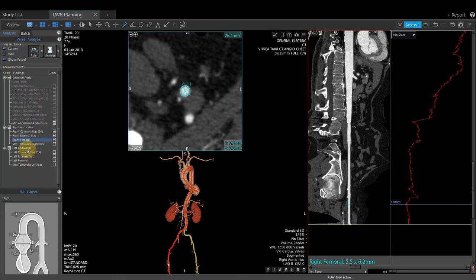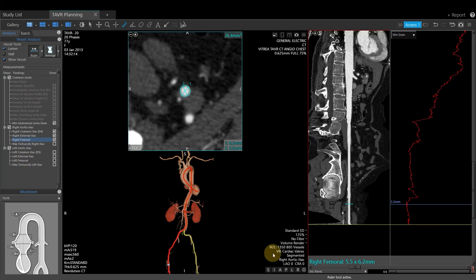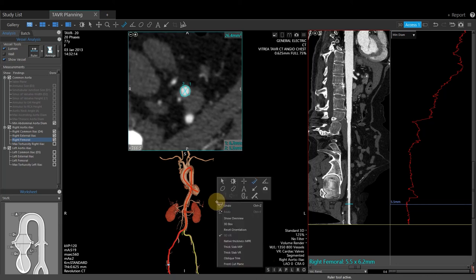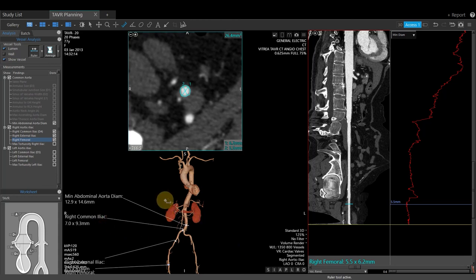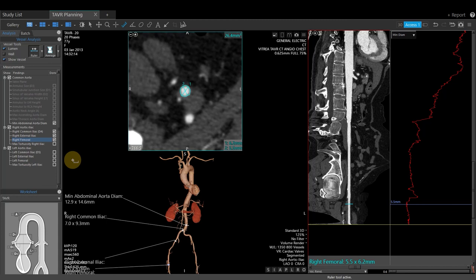Create the same measurements on the left aortic iliac vessel as well. Now that the workflow is complete, we'll go through some additional functions. If you right-click on the 3D image, select 'Show Overview.' This will give a 3D image displaying the completed measurements. Since we are only on the access phase, only the access measurements are displayed. Click the camera to take a snapshot of this image.